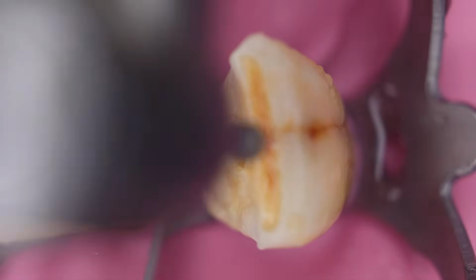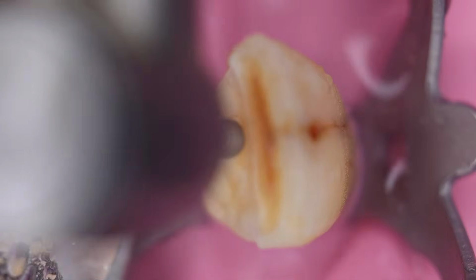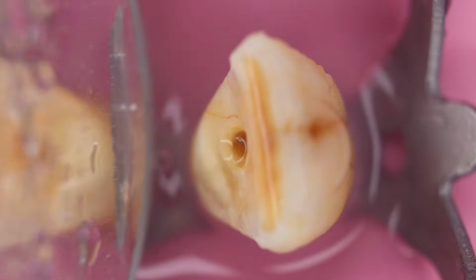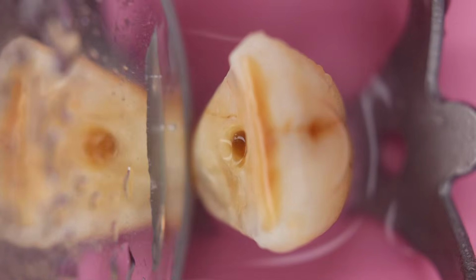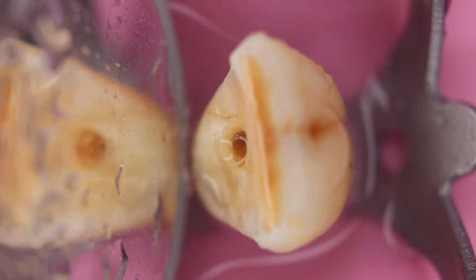And now going in along the long axis of the tooth. Now you should be able to get the burr drop. So the burr drops, and you would feel that once you see it.